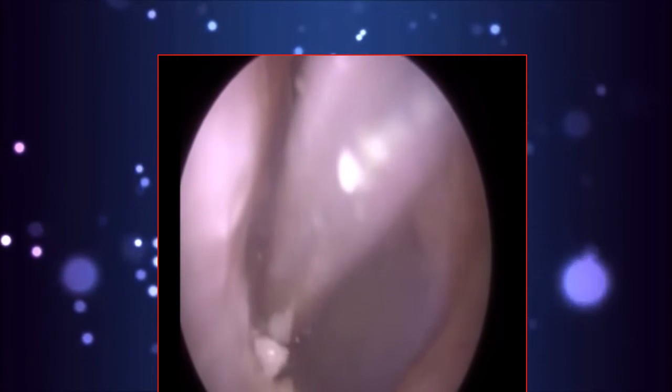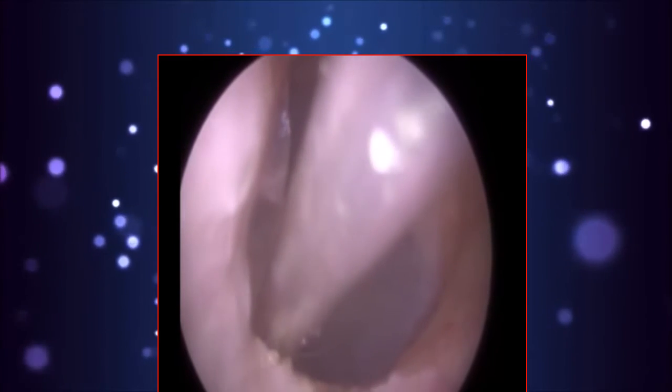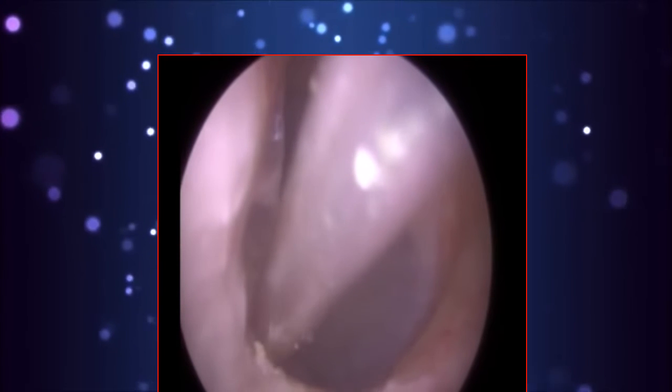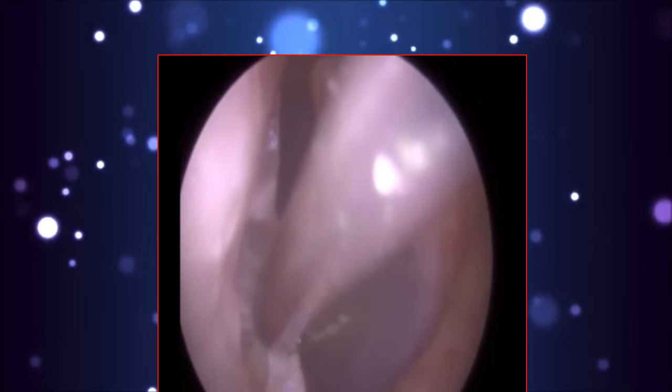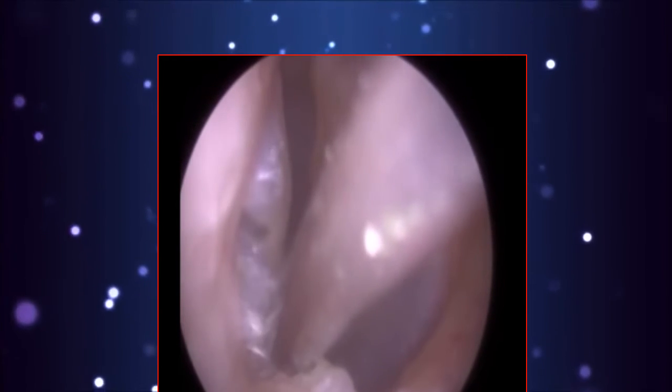So again, we're really close to the eardrum, so we have to be really gentle here. We're on the bony part. So again, if we make contact with this bony part of the ear canal, this patient won't be very happy, and he probably won't be coming back here.